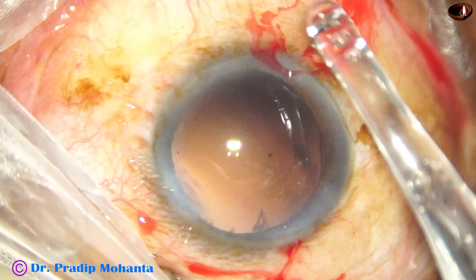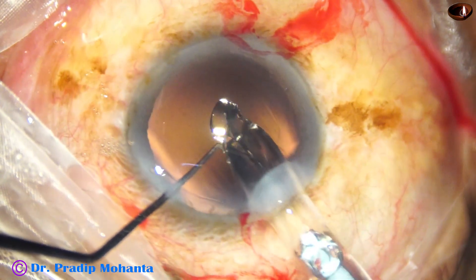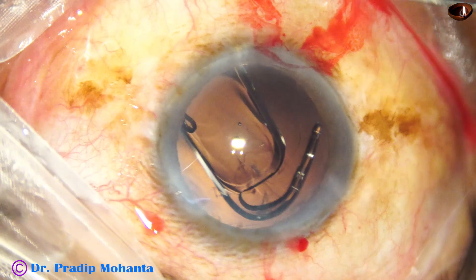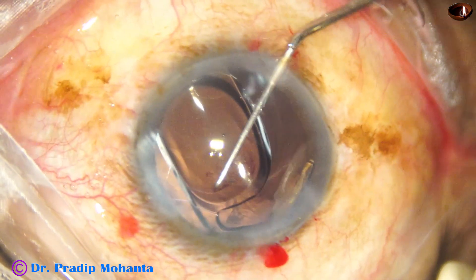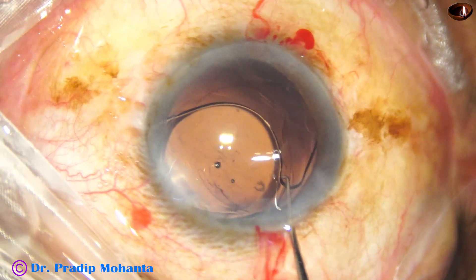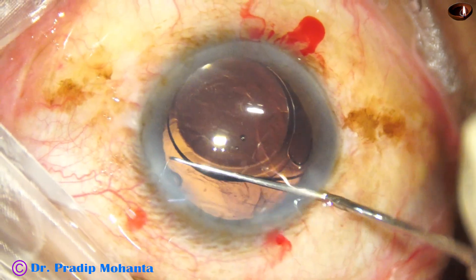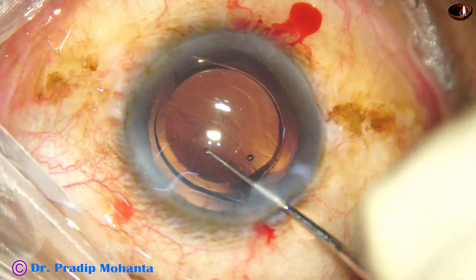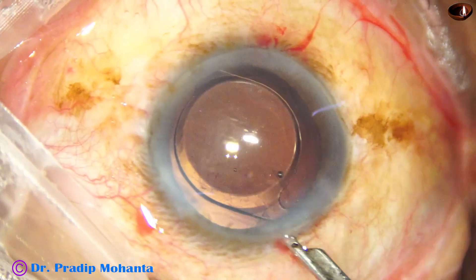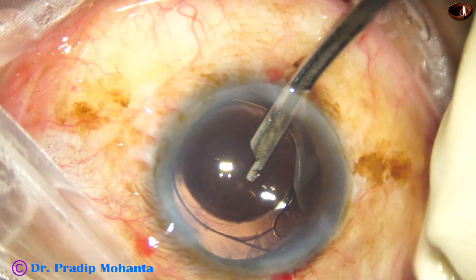Now watch how to place the lens in the capsular bag. The leading haptic goes into the capsular bag, but I cannot simply push and place the trailing haptic in the bag — if I do that, there will be a lot of stress on the zonule and more zonular fibers will be torn. So I dial the lens, bring the leading haptic to 12 o'clock, and place this haptic in the bag. The haptic at 12 o'clock now gives extra support to the area of zonular weakness.